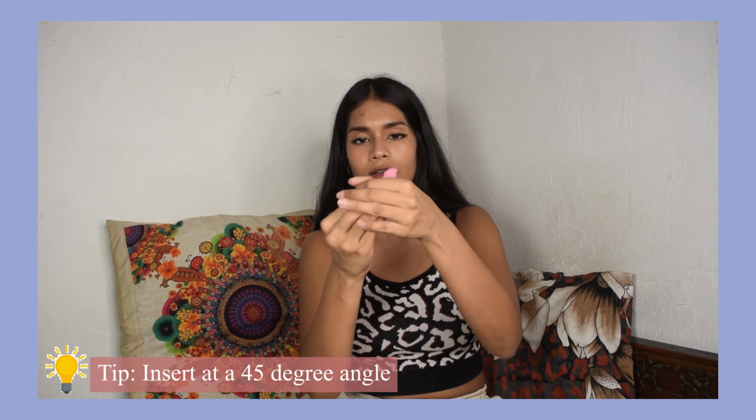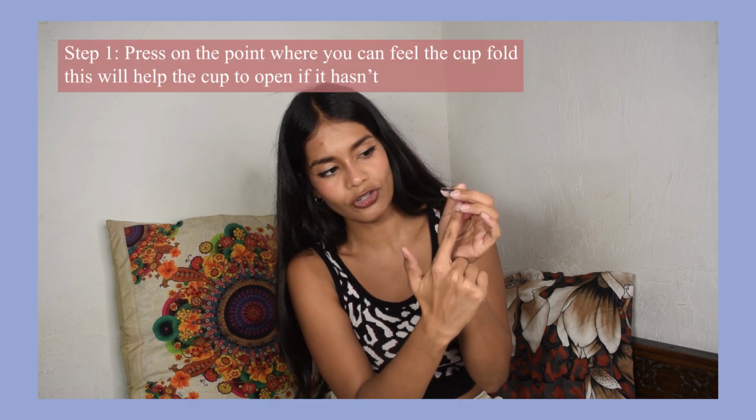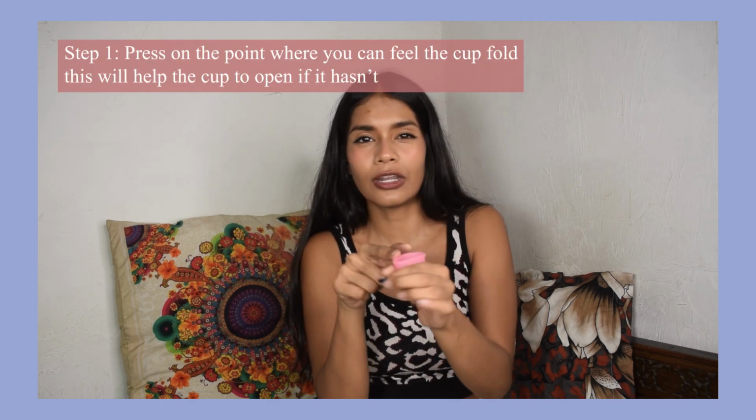So a tip I will give here is once I do the punch down fold and I insert, because of the pressure of the walls inside, it does not fully open. It just stays like that, and that is what causes it to leak. So what I do is I will insert my finger from below and just press on this. If you keep pressing, it slowly opens up.